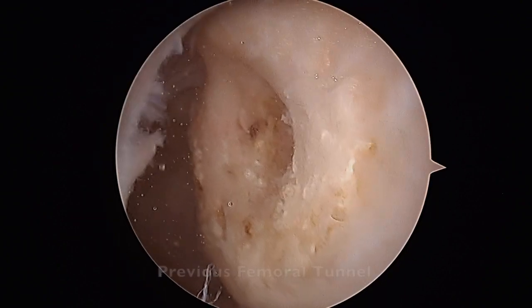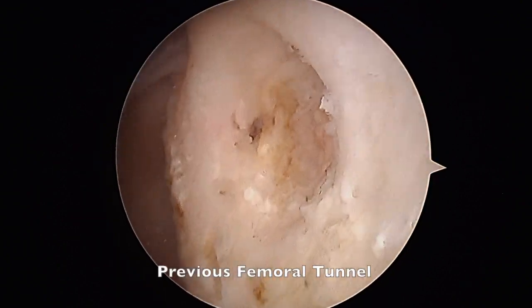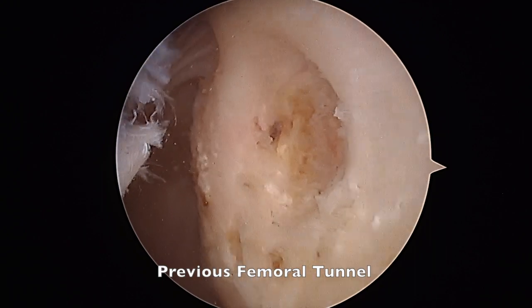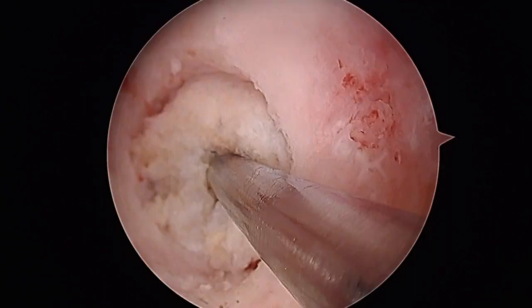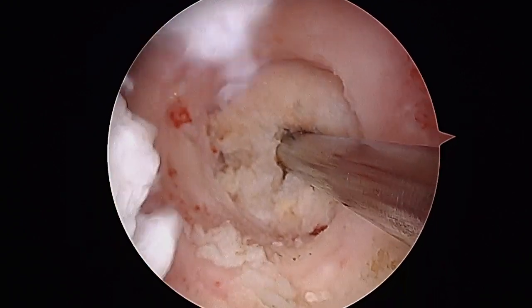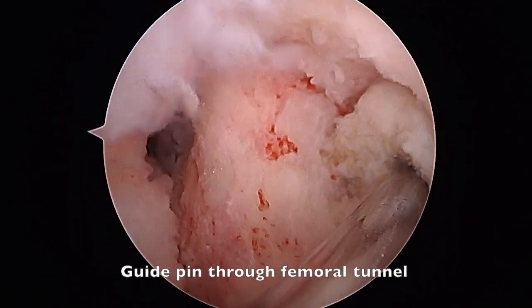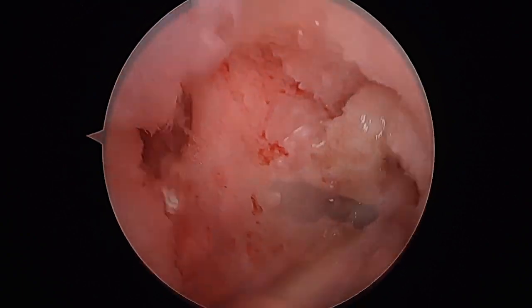The previous femoral tunnel is then identified and prepared by placing a pin within the center of it and reaming the femoral tunnel to a fresh bleeding bony surface.